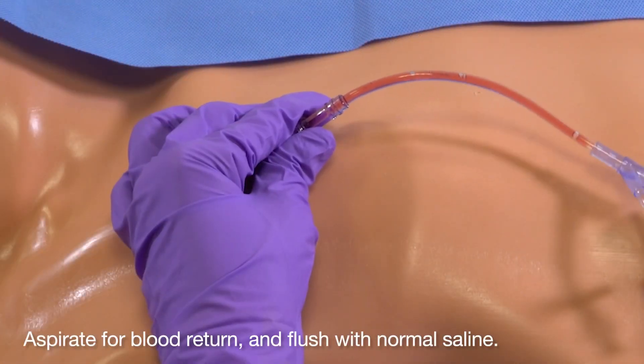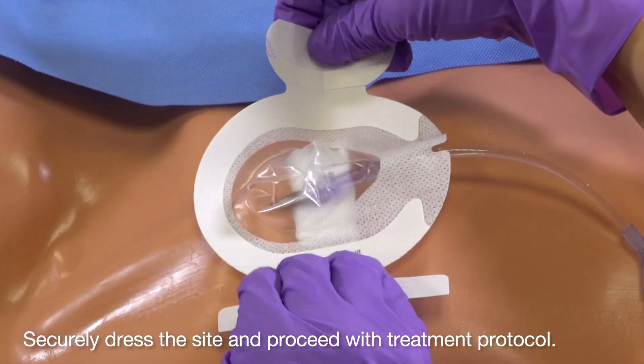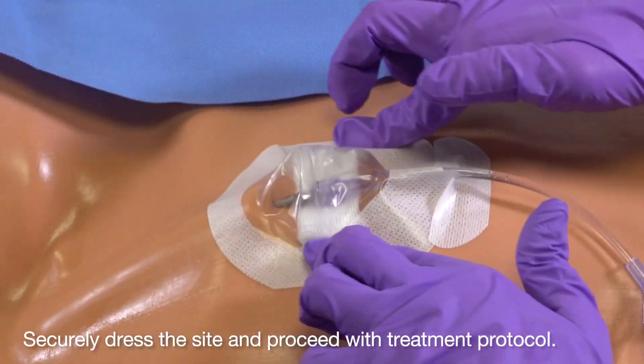Aspirate for blood return and flush with normal saline. Securely dress the site and proceed with treatment protocol. Folded gauze used to support the catheter hub may help with optimizing flows.